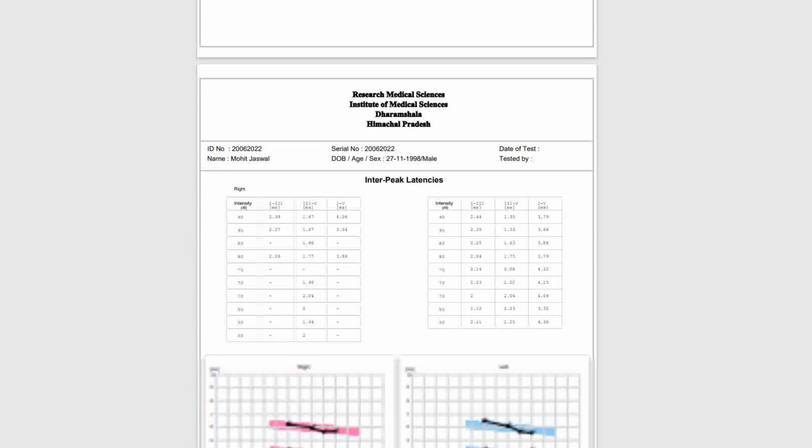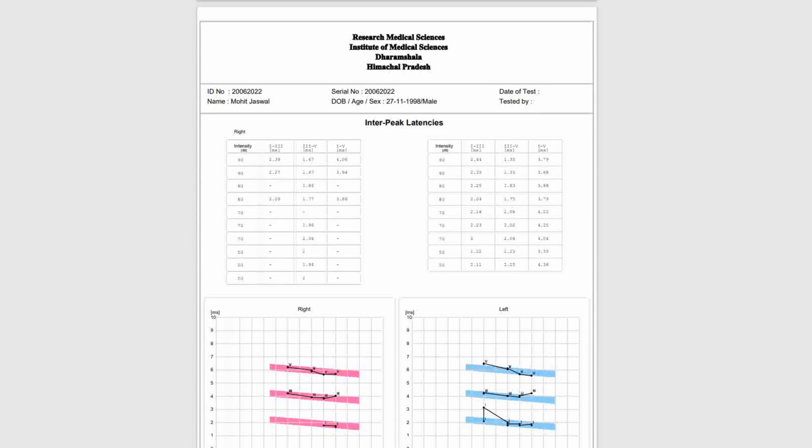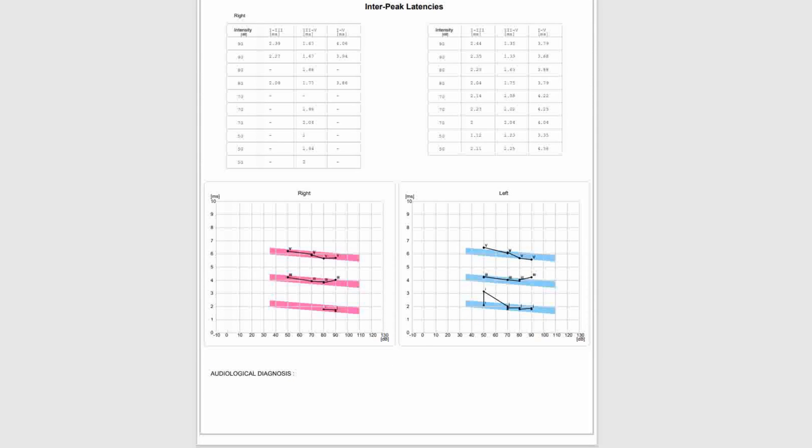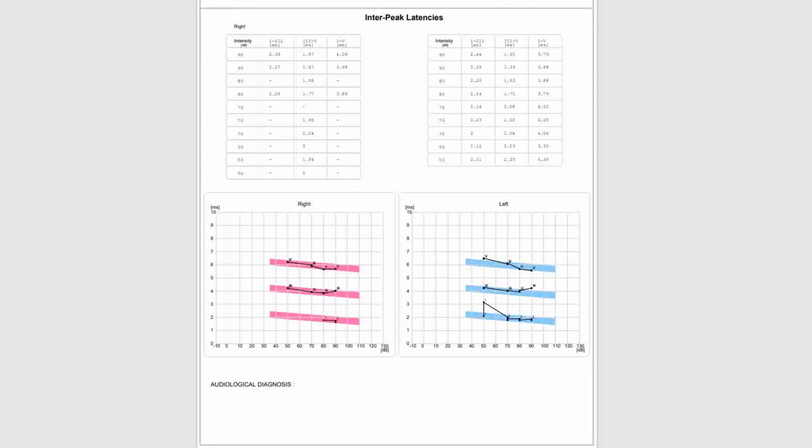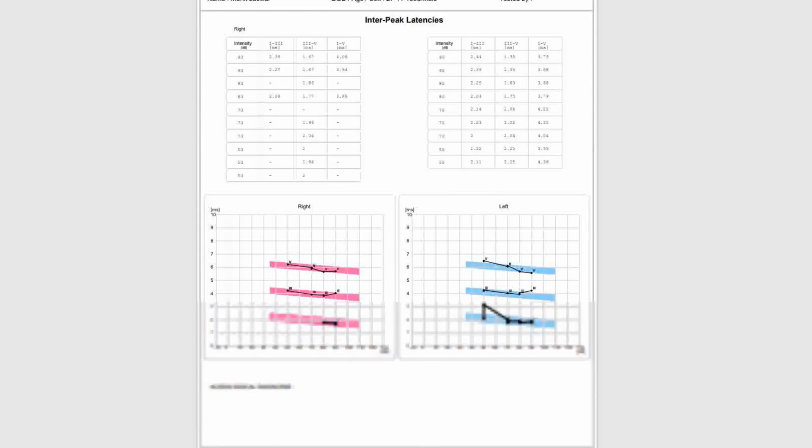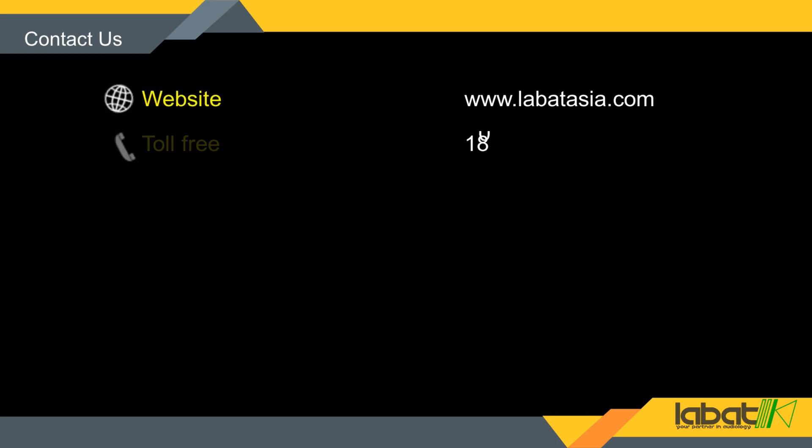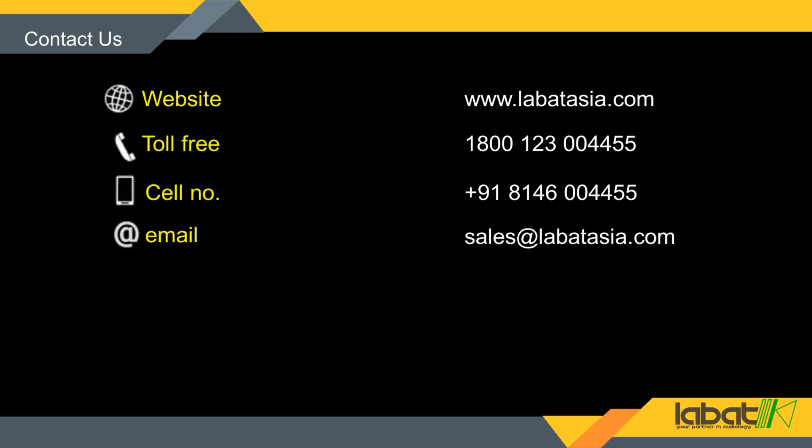Also, you get latency graph and values. At the end of report, you can see the comments section.